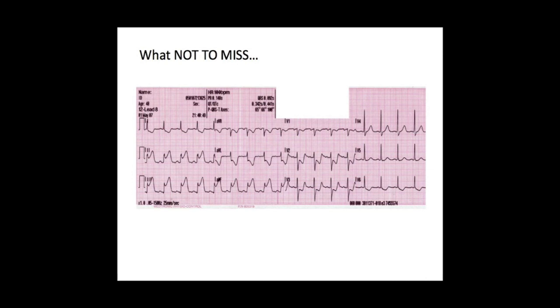Here's an example. Say this is a patient with chest pain and a history of chronic stable angina. As you can see, this ECG shows gross ST elevation in leads II, III, and AVF. This is the characteristic pattern of an inferior MI. However, there's more to note in this ECG: if you look in the chest leads, you will also notice that there is ST depression, particularly in V2 and V3. These are what's called reciprocal changes, which occur as a result of having had the inferior MI.